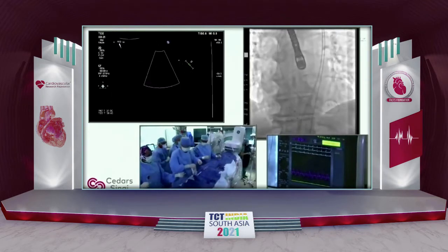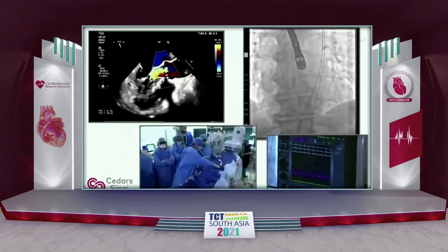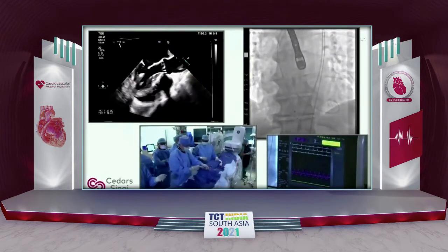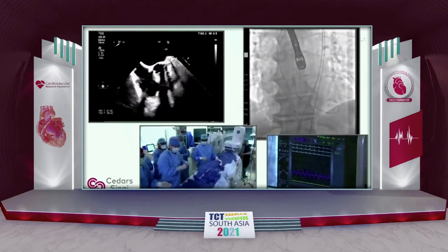We generally have, but the newer platforms moved away. I remember the times when this was the old Sapien and you had to pre-dilate. Yes, and that was correct, mostly to facilitate crossing. With heavy calcification, I still am biased towards pre-dilating. I think it leads to a more symmetric expansion.